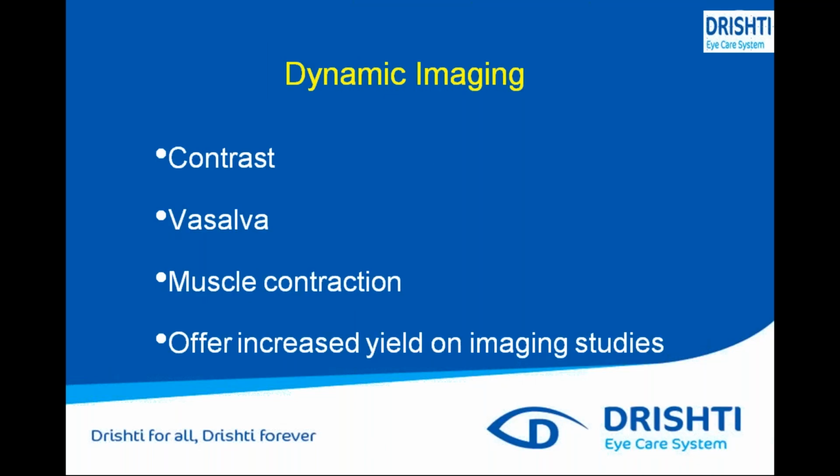Nowadays the scans have become more advanced, so it is called dynamic imaging. In dynamic imaging, the advancement is that contrast has come. Sometimes your mass and your vitreous look the same in color. If you are not able to distinguish the exact location and exact area of your tumor, in those cases you can increase the contrast. With contrast, the bony areas and your orbital area will be enhanced, so you can easily identify the exact location of your tumor. This is done in special cases.